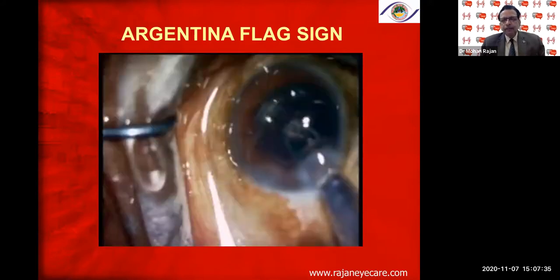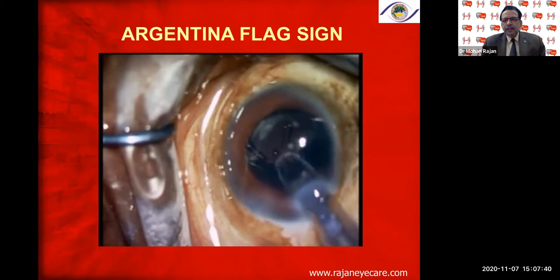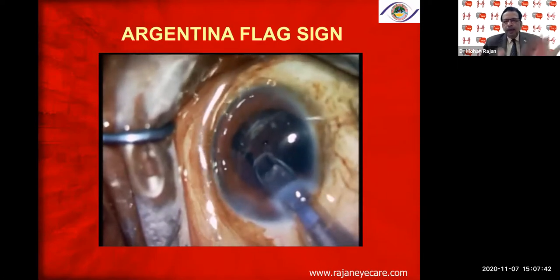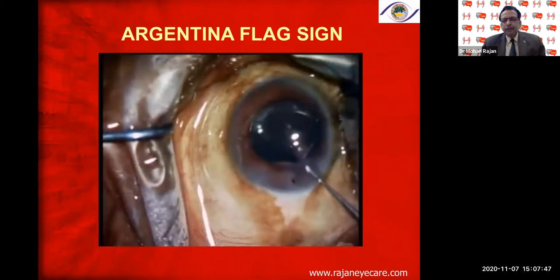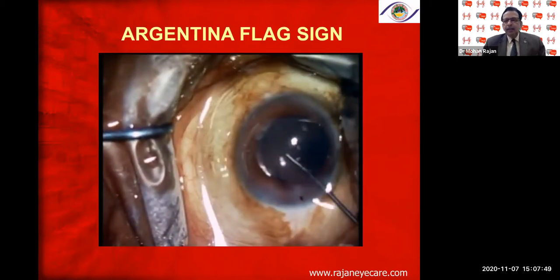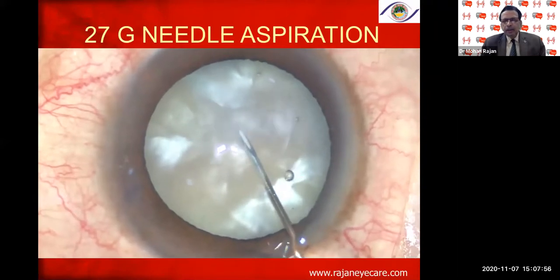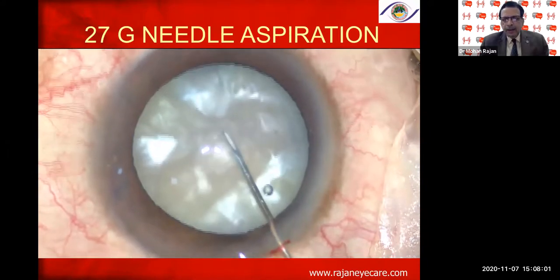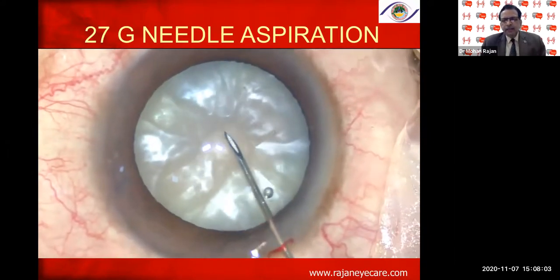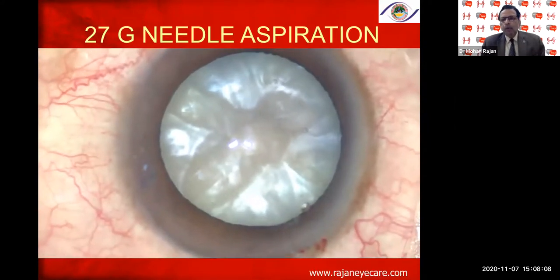You can see here, I'm injecting a foldable single piece lens, positioning the lens in such a way that it is 90 degrees away from the tear, what you see in the Argentina flag sign. You can use a 27 gauge needle or a 26 gauge needle or even a 30 gauge needle and aspirate the cortex which is there in the front compartment, going through a very small opening.